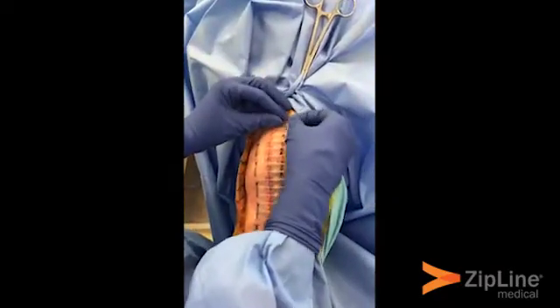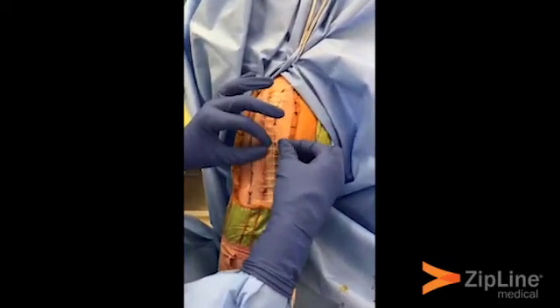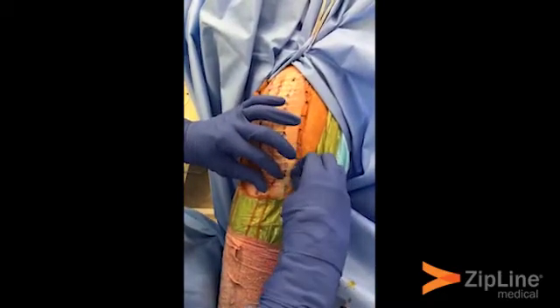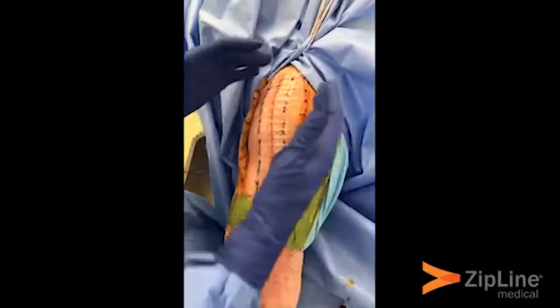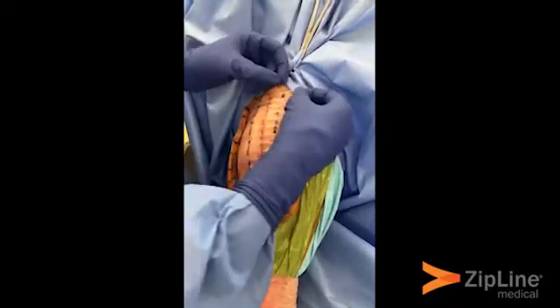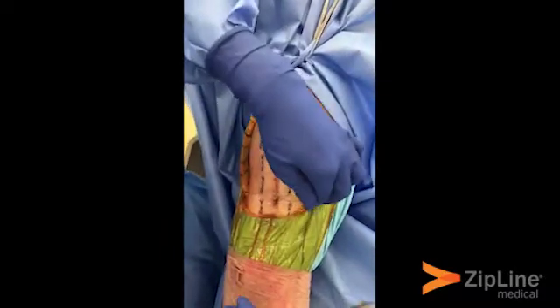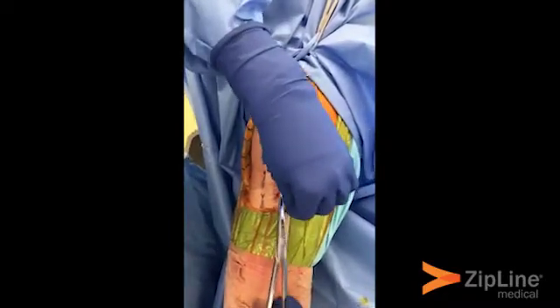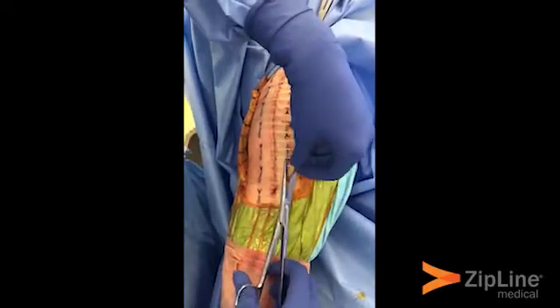Pull each zip tie about three clicks by holding the little knob and pulling it three clicks each. If you feel that different areas of the incision need a different amount of closure, you can do a few more clicks, and you can even loosen them if you've over-tightened. Finally, use suture or bandage scissors to cut the tabs — I prefer suture scissors because they're less bulky.